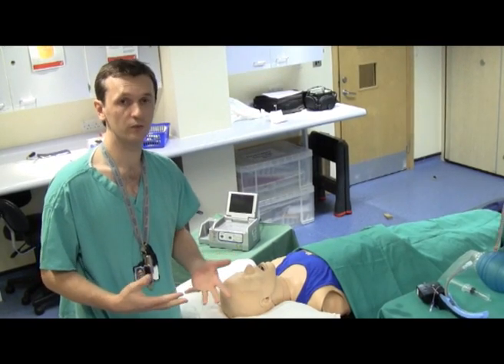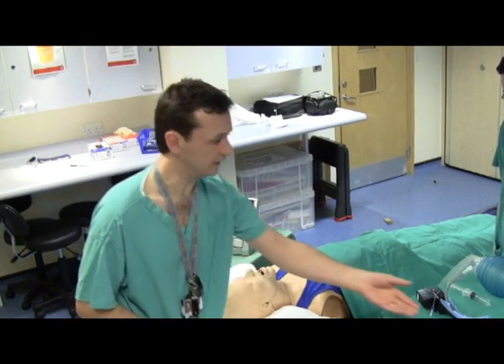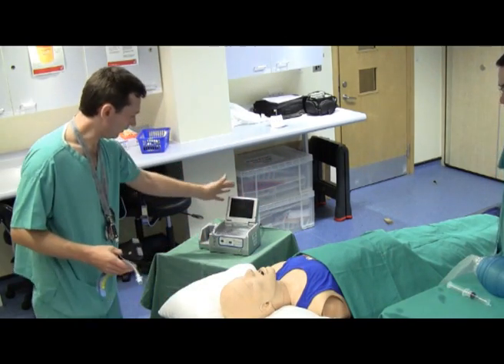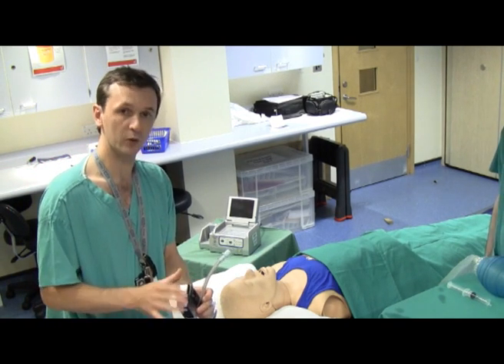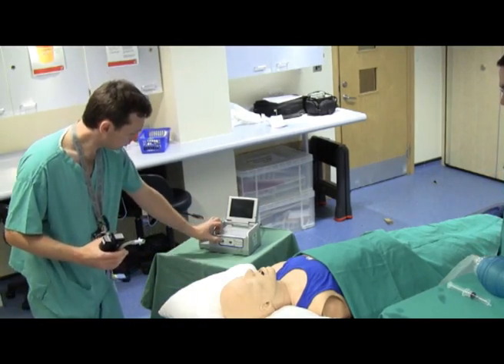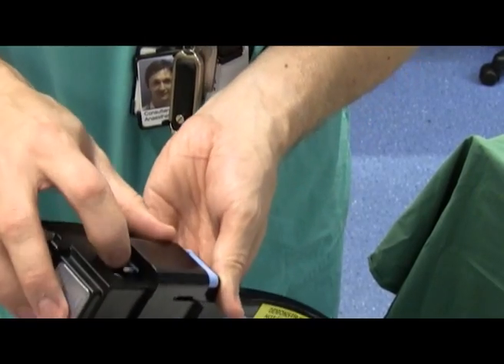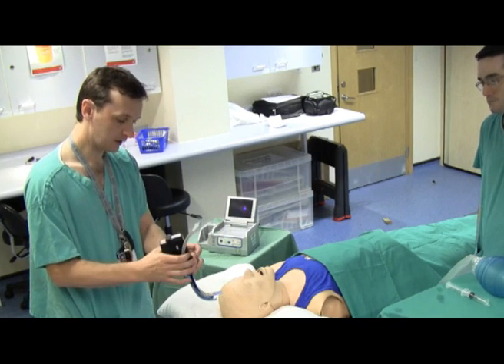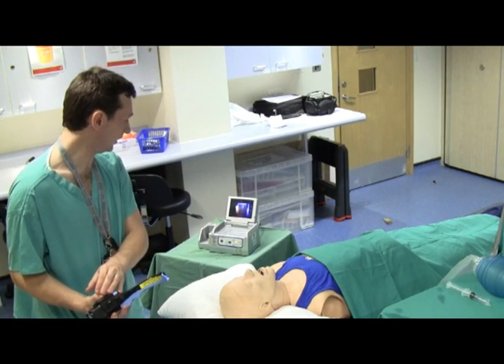Now I'll take you through it step by step. The Airtrack system consists of the laryngoscope itself, a video viewer, and a camera head. Switch on the viewer with the power button, switch the wireless camera on, and you'll then see an image on your viewer. Finally switch on the Airtrack again and your light source is activated. So now you're ready to intubate the mannequin.